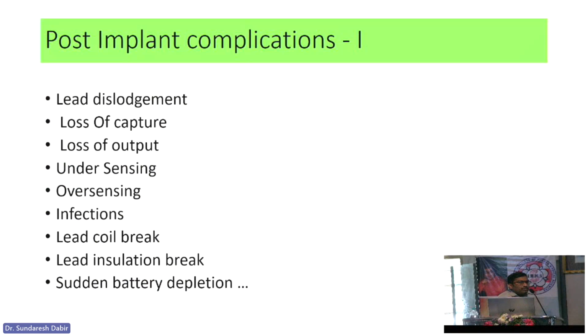Okay, post-implant complications. These are very important points: lead dislodgement, loss of capture, loss of output, undersensing, oversensing, infections, lead coil break, lead insulation break, sudden battery depletion. These are the main, very important points which we need to read and understand. Make sure of this; it is very important with the pacemaker topic.